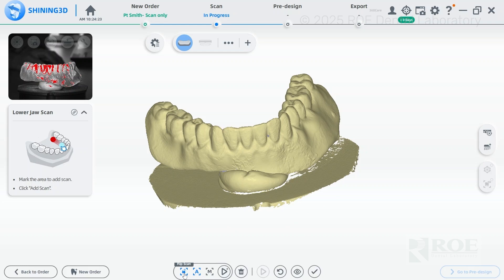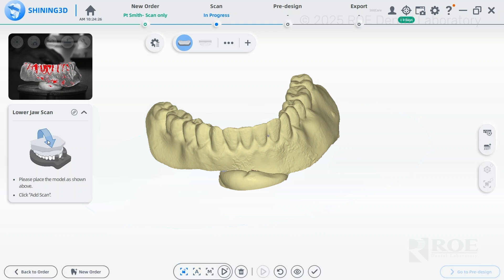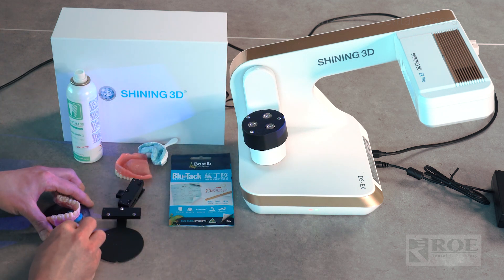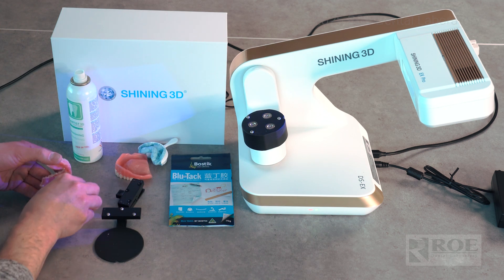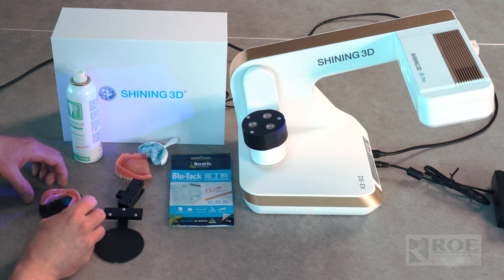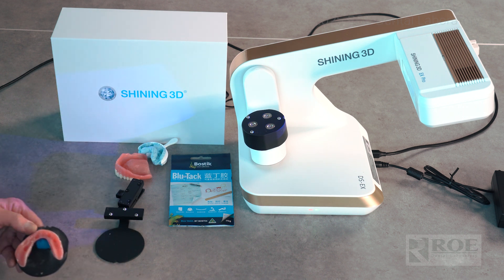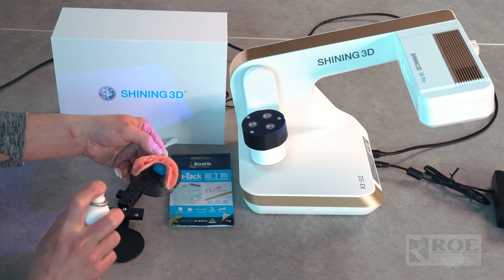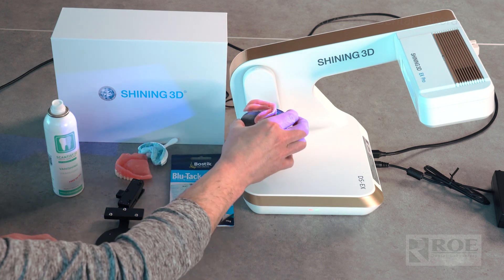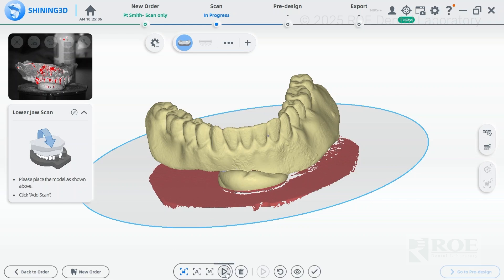To do the intaglio surface, go to the little 'M' in the window and flip it. The screen will indicate to flip the model or denture. Remove it from the plate, bring the blue tack up a little more, and place the denture with the intaglio surface facing up. Make sure it's nice and stable. Use the scan spray again, and align notch to notch.